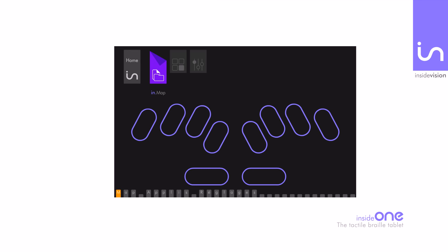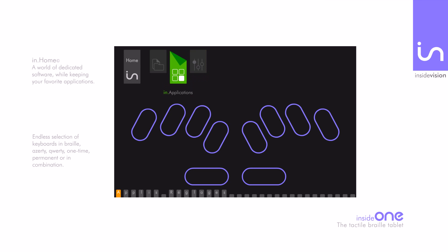You can also directly work in our own ecosystem called InHome. InHome is a dedicated ergonomic software suite, exclusively available on InsideOne — a world of dedicated software, user-friendly even for sighted people, thanks to its outstanding ergonomics.